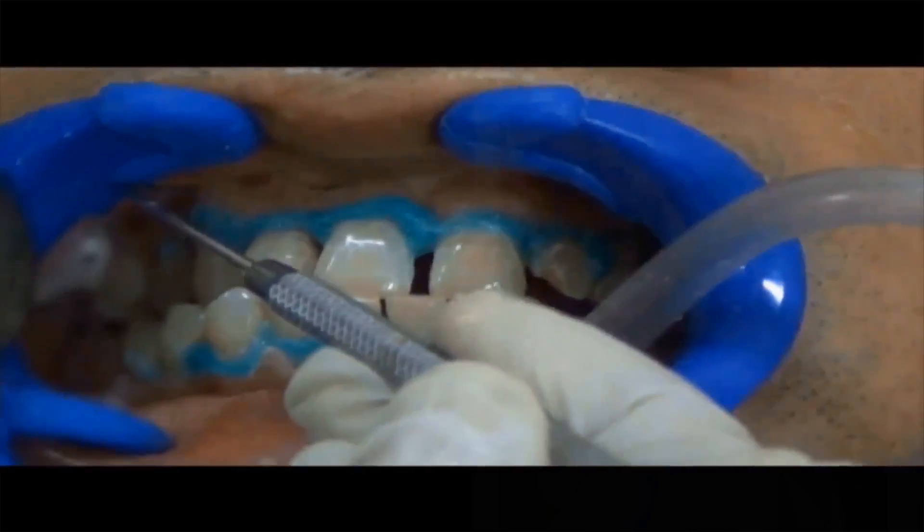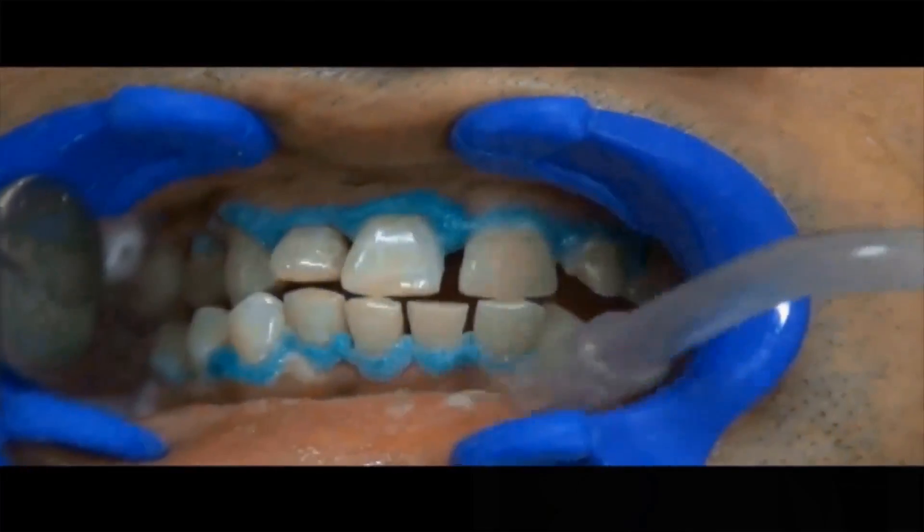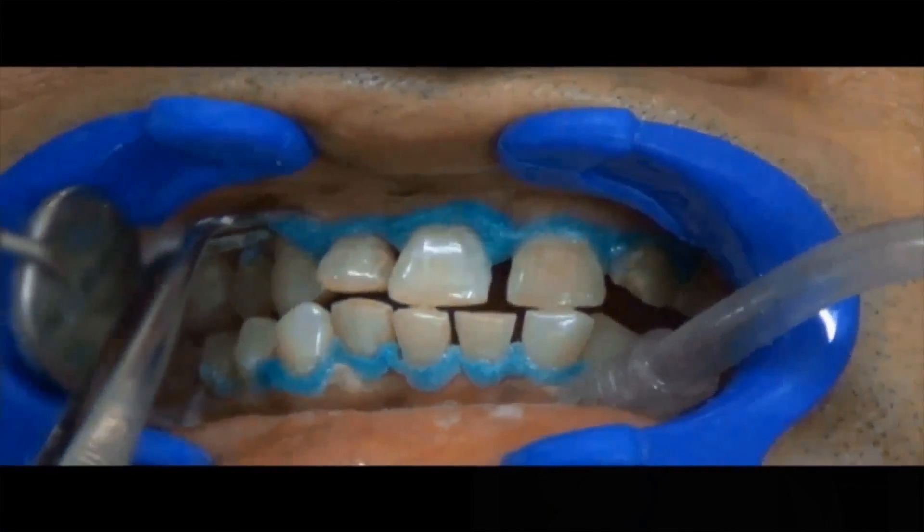Use the tip of the dental instrument, gently slide the tip of the instrument beneath the liquid dam and lift it off.